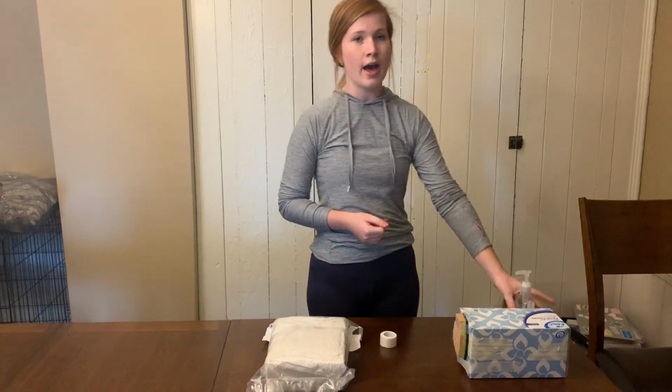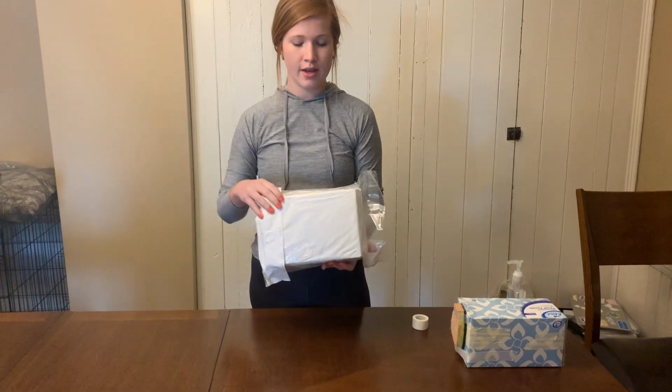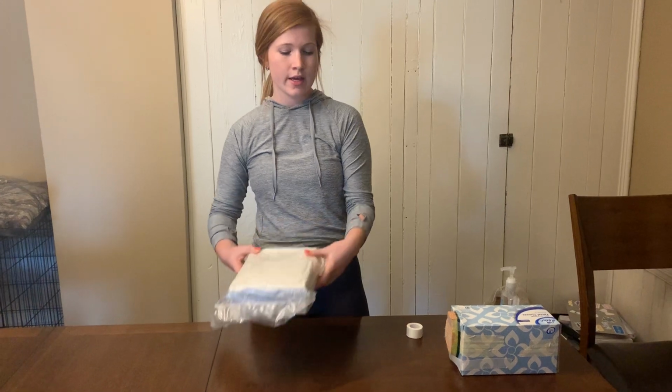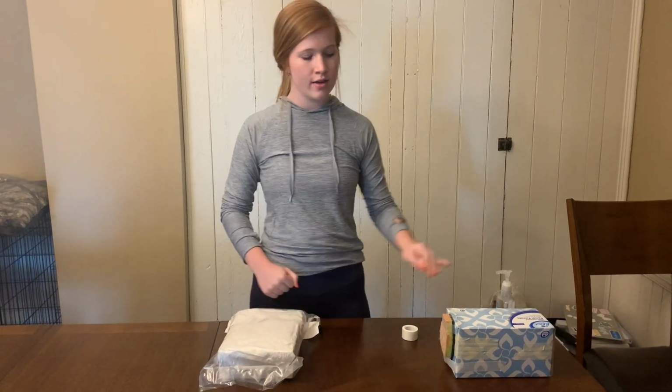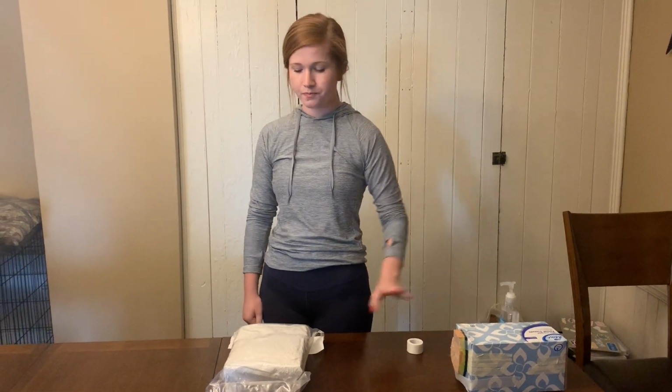So before I begin, I'm just going to make sure I have all my supplies assembled. I have my hand hygiene, my tape, and my sterile catheter kit. This one obviously is no longer sterile because I practiced with it, but in the clinical setting, each patient gets a new sterile catheter kit. And then I have my patient model here, and I'm doing a female.